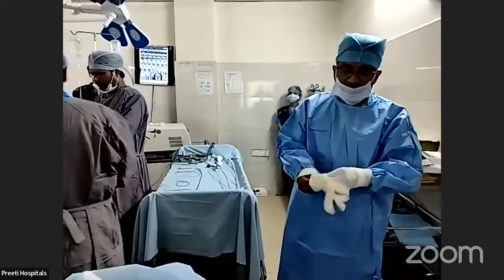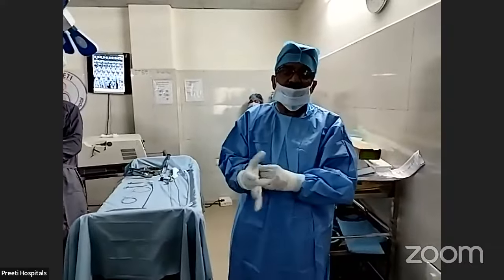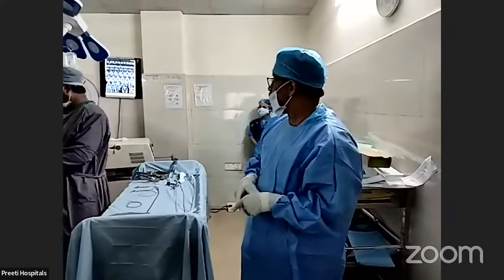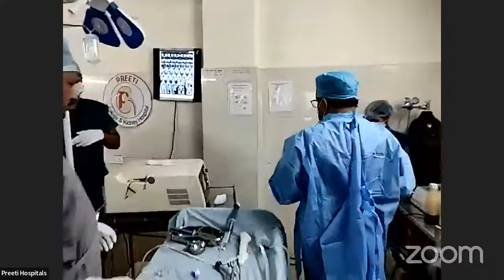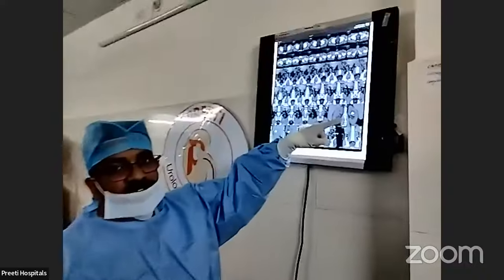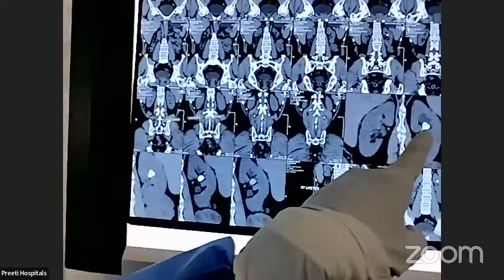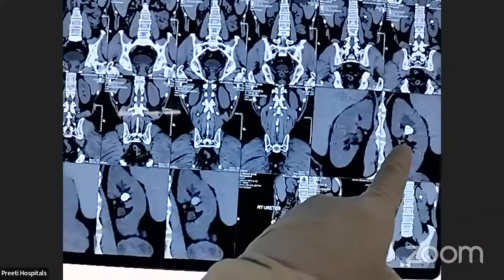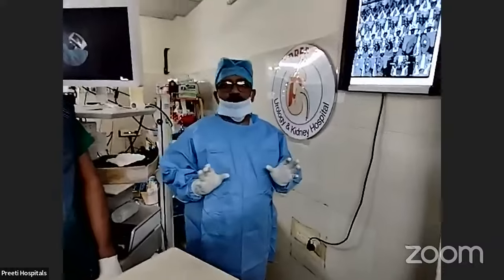Today, we are demonstrating live surgery for a 1.5 centimeter stone. I wanted to show the CT before I introduce. If you see the reconstructed picture, this is the stone, approximately 15 mm. There may be a small infundibulum here, but we will go and see inside. This is pre-stented already, so that ureter will be accommodable.